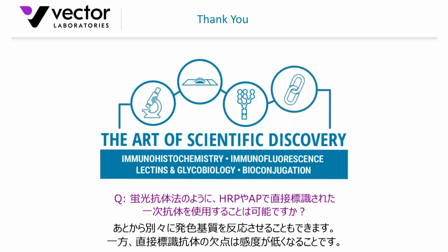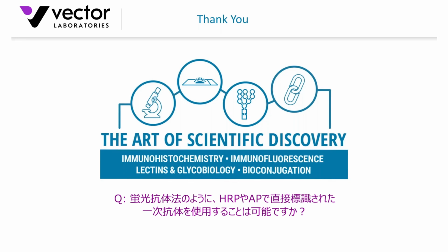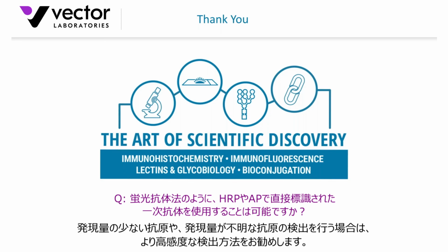One point of caution with directly conjugated primary antibodies is that you will experience low sensitivity with those. So if you're looking at a weakly expressed antigen, or antigens of unknown expression, or upregulation or something like that, you may want to go with a more sensitive detection methodology.